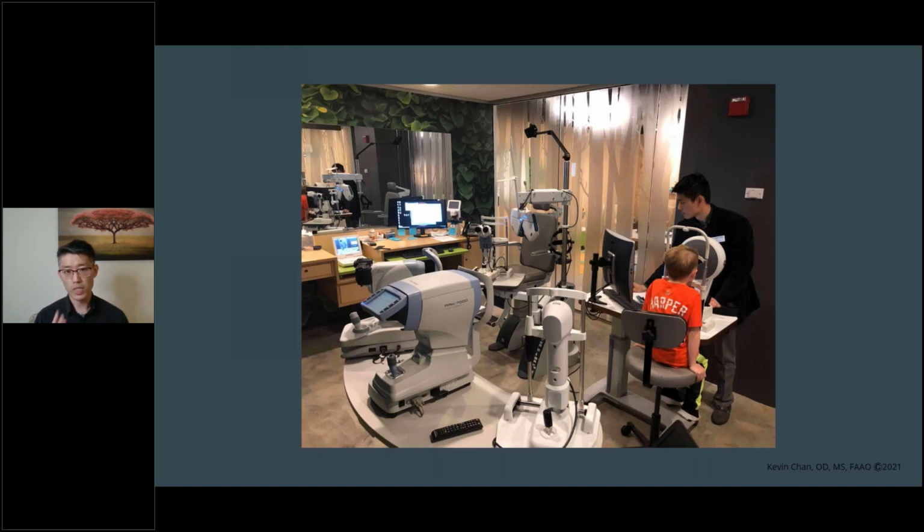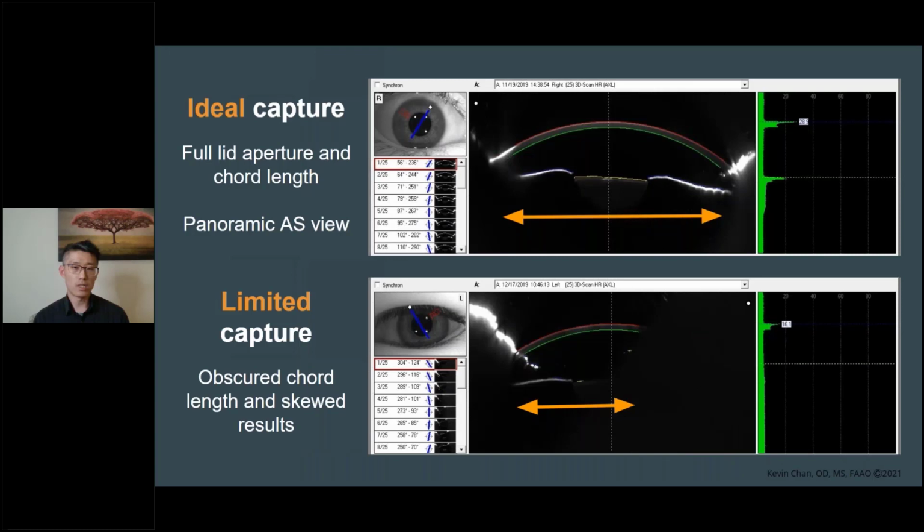So for clinicians who are considering some sort of optical biometry but not quite sure whether it's doable for kids, my answer is yes, but it definitely takes some experience and a learning curve to know how to deal with a young population like this. In terms of taking good quality images, I learned this from mistakes and tons of repetition. And I found that a lot of clinicians take pictures of really poor quality, so eventually they are not able to interpret the data reliably.